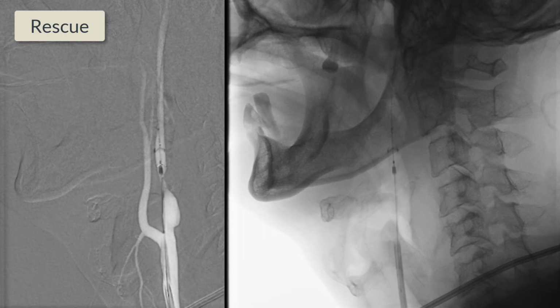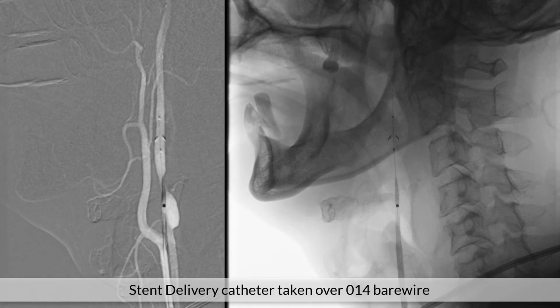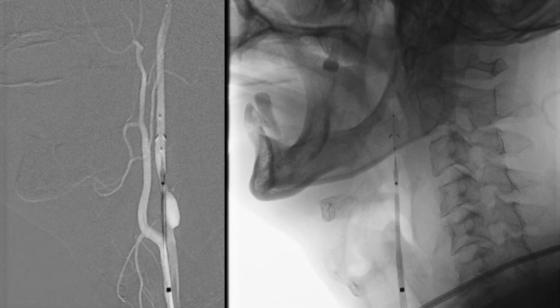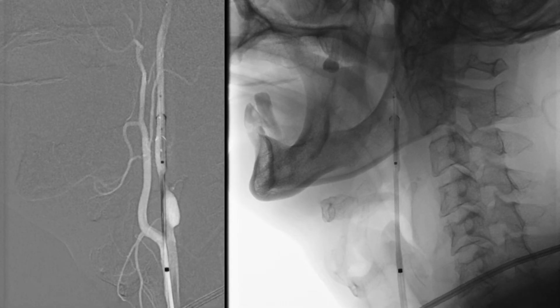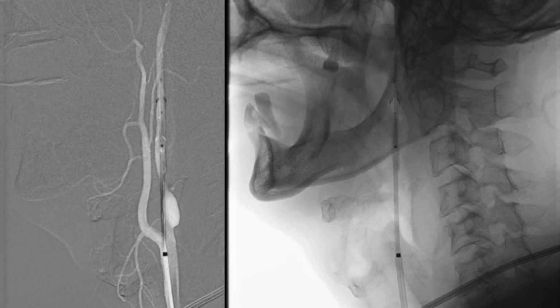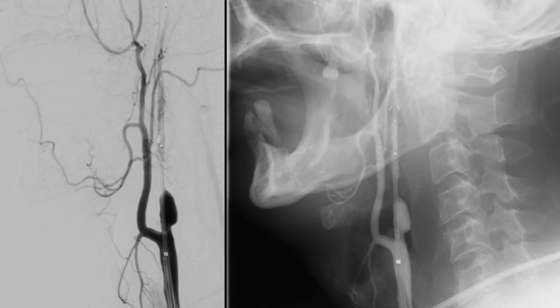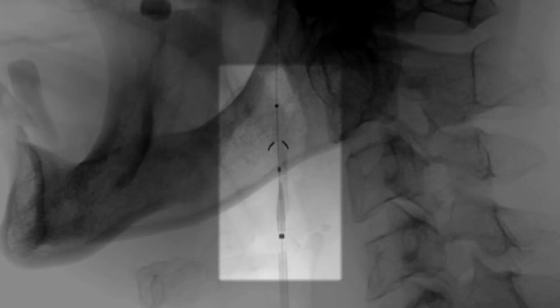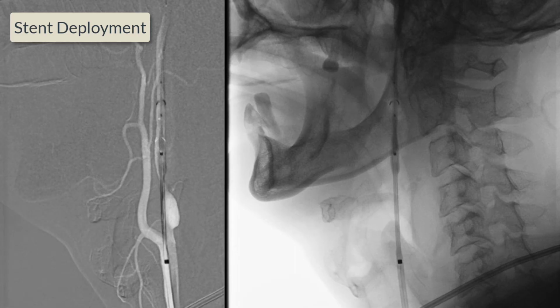We gently pushed the filter device upward using the retrieval catheter. Now the stent delivery catheter was taken over the 0.014 bare wire. The distal nose of the stent delivery catheter further pushed the filter device to the desired location. Precise location of stent was confirmed by guide catheter injection. Stent was deployed and delivery catheter was removed.